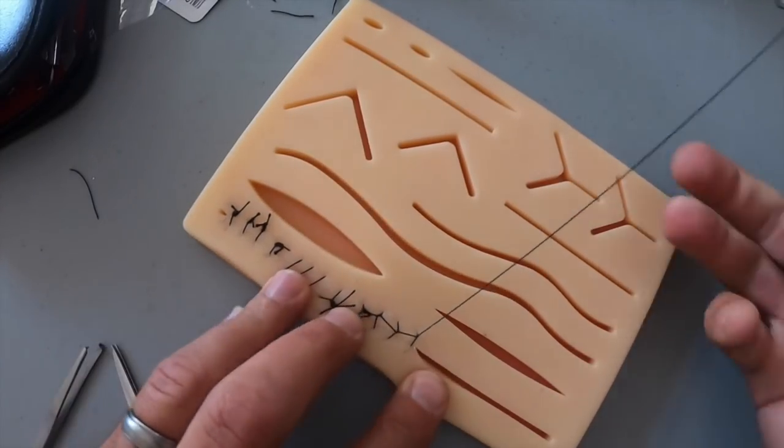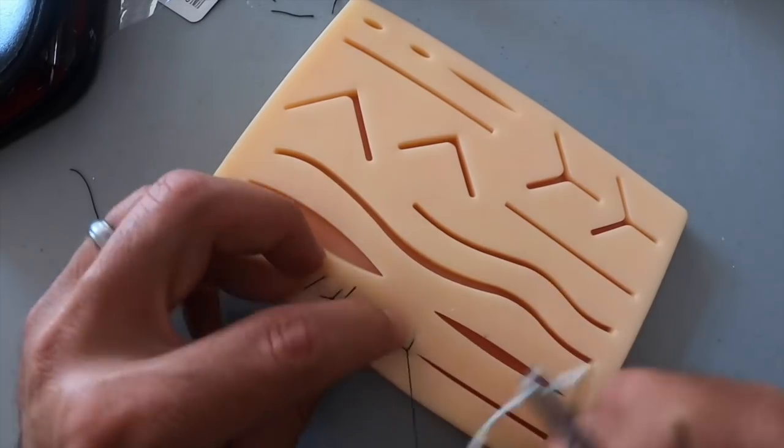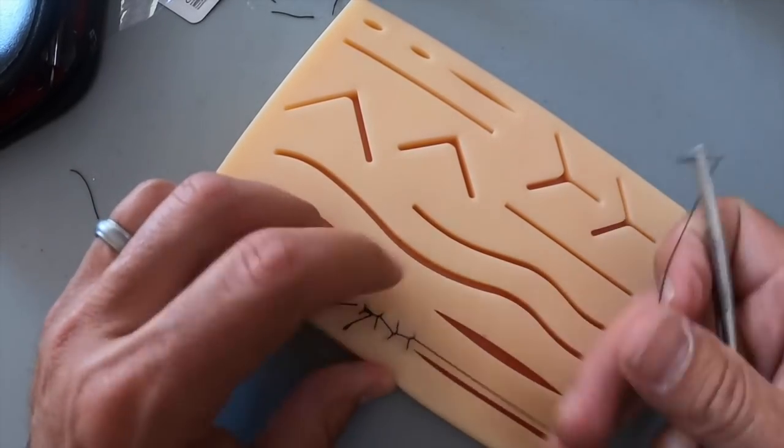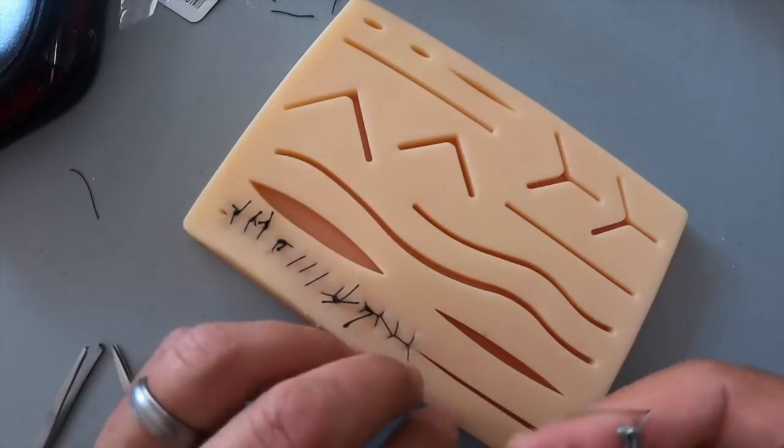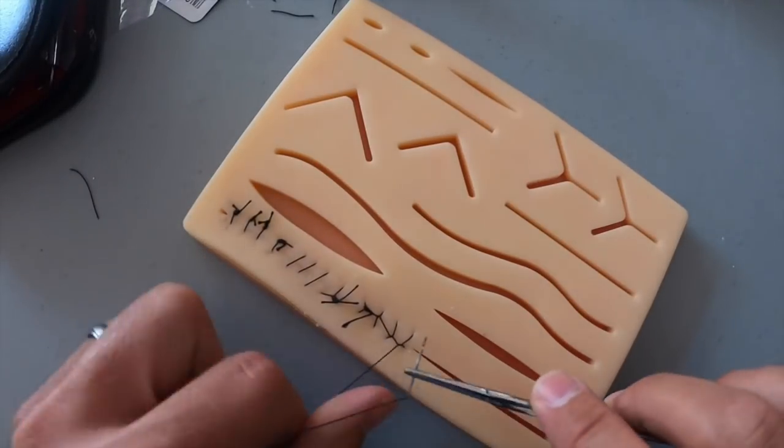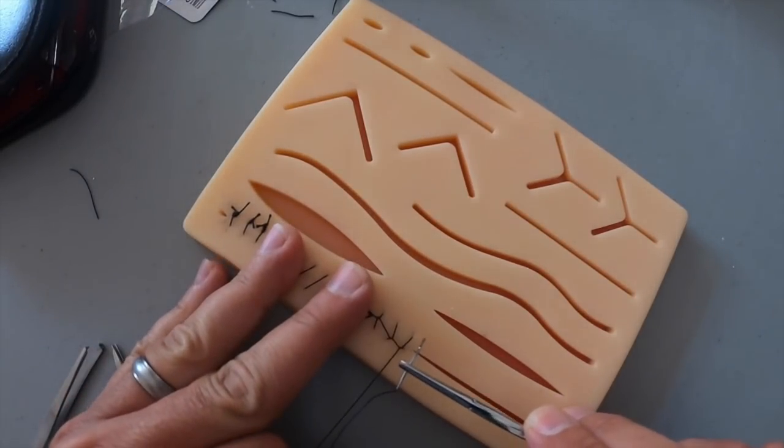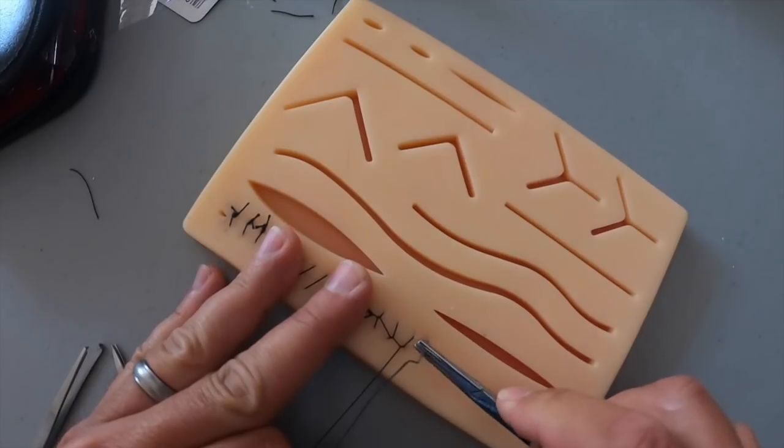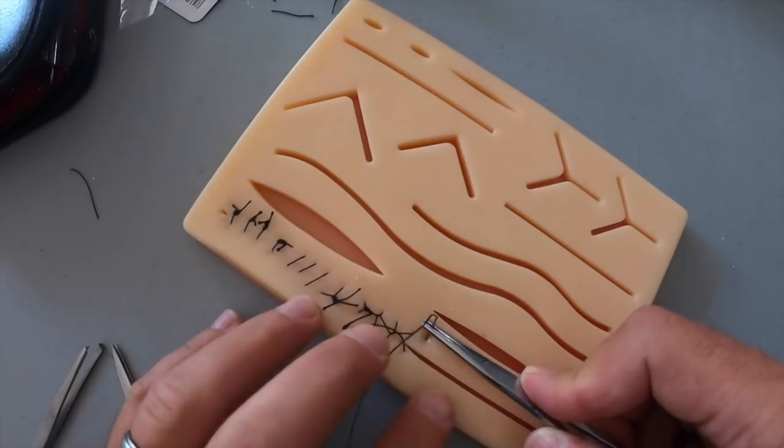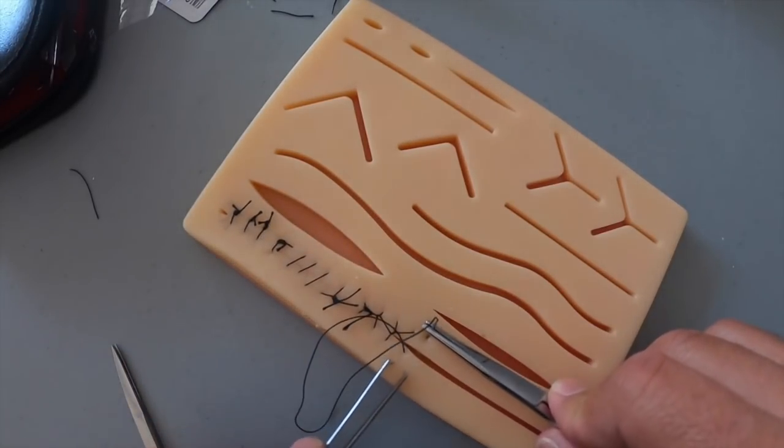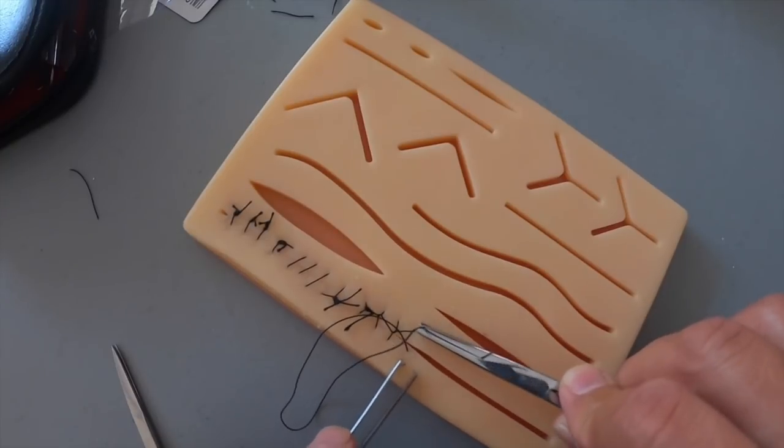You can move this like that, you can move to one side or the other, it doesn't really matter at that point. We'll do our last one, in and out with your instruments, you don't want to pinch yourself there.